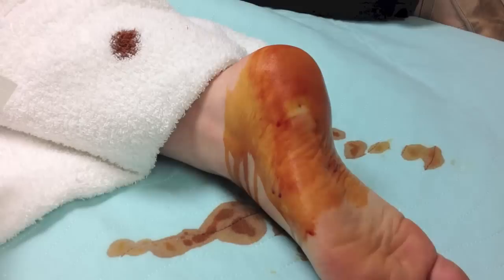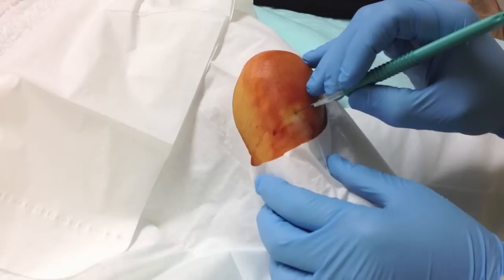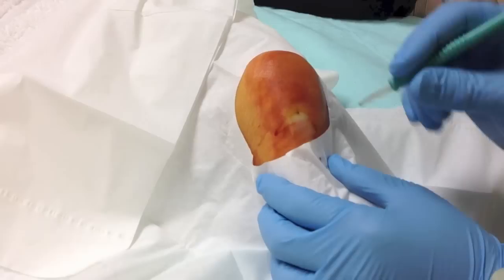I'm going to make sure it is numb and cover the rest of it. You will feel pressure, but is it sharp pain at all? No. Good. So what we're going to do is make a cut so that we can actually explore the wound.